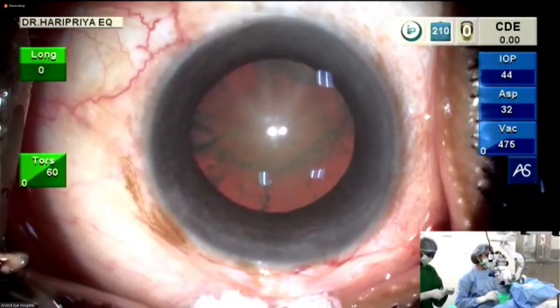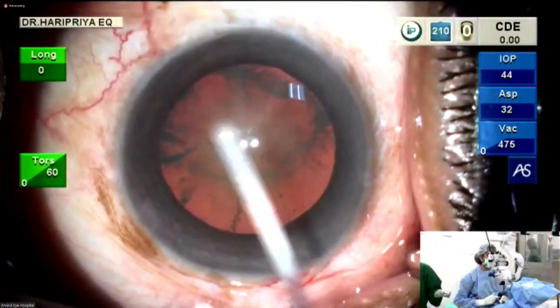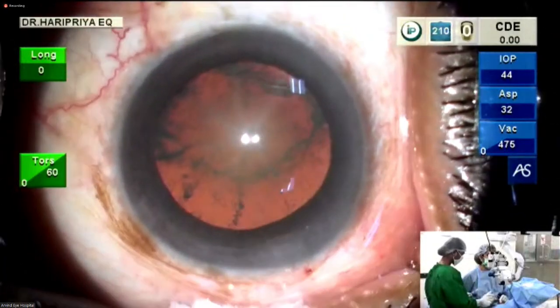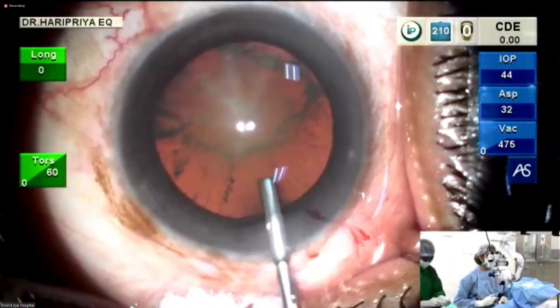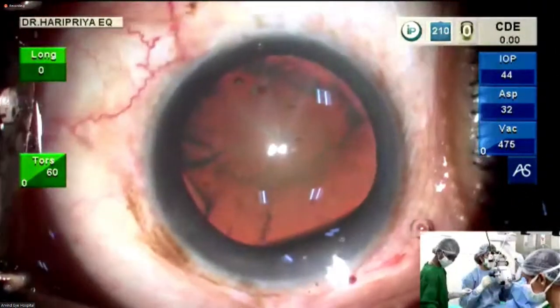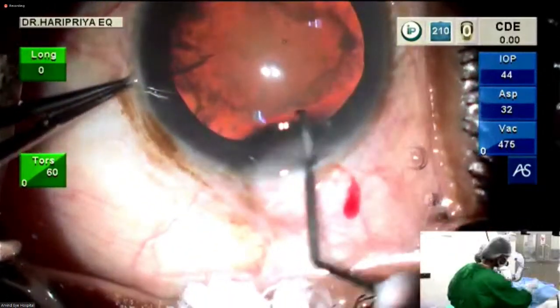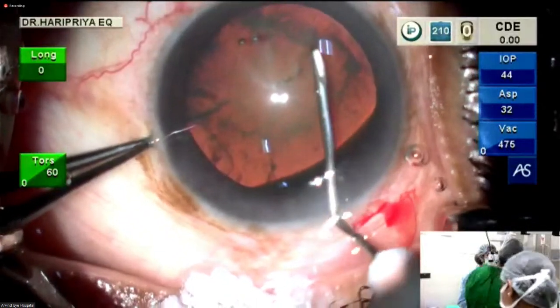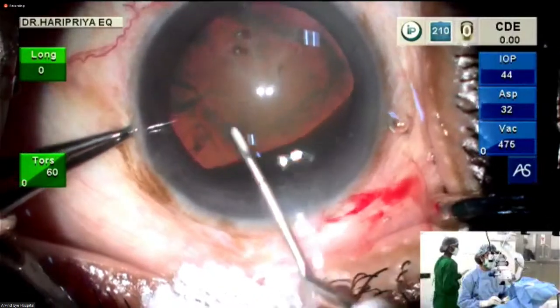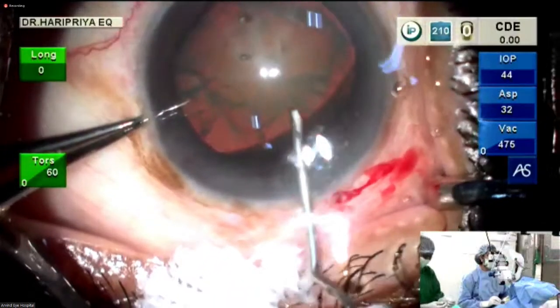So in a harder cataract, it's better if the capsular rhexis is larger, so you have more working space. This is much more important in an SICS surgery, obviously, but phaco as well. If you have a harder lens, it's better to have a bigger rhexis, so you have enough space to elevate these fragments, which are more difficult to maneuver. The capsule also is thinner in these harder cataracts, so you can make a larger rhexis quite easily without the risk of it going to the periphery. There's a subcapsular component to this cataract as well.